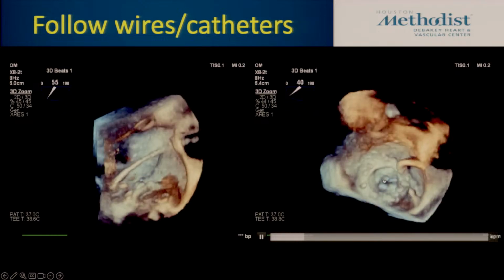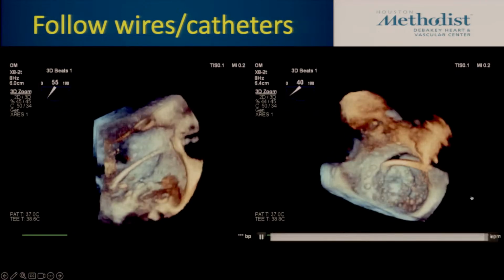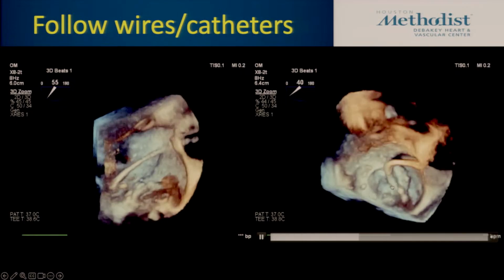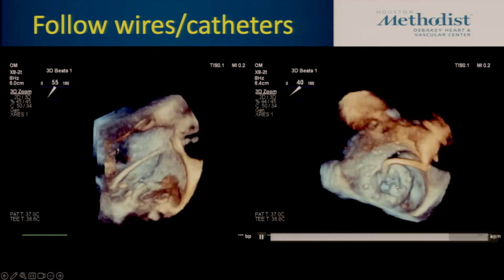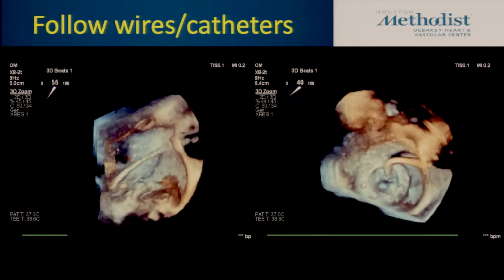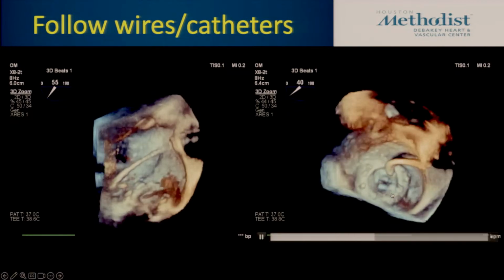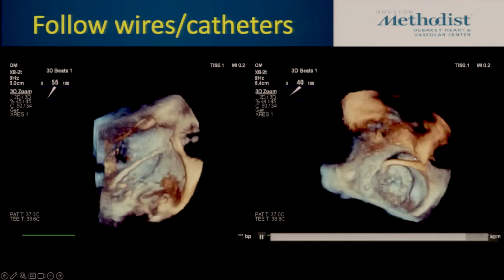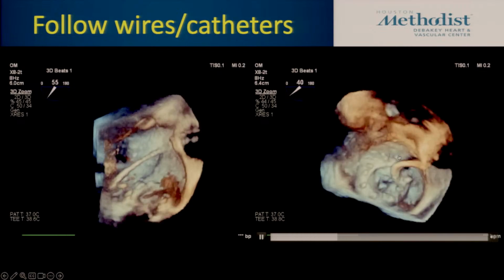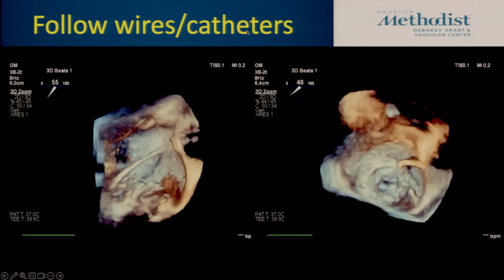The catheter is trying to be directed across the prosthetic valve, the stenosis. The fellow in this case is sort of probing with a little wire. He keeps missing it, and you give a little bit of advice. So you have to be a little more anterior, clock your catheter a little bit so you're aiming in the right spot. But you're giving very direct feedback based on the real-time guidance of these things. And again, you see a different shadow over here. So recognizing what the shadows are, they're not tears, they're just data voids. That's part of the effort.